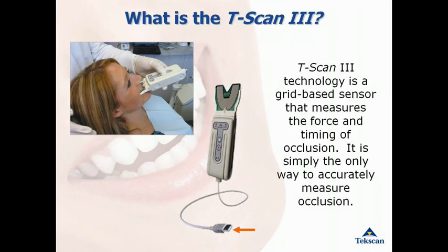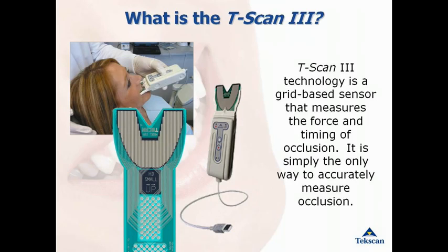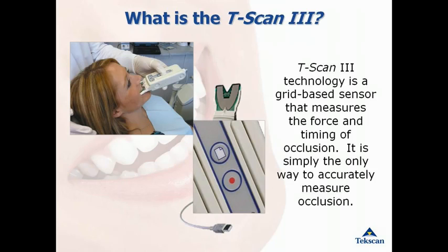The handle connects into the USB port of your PC and is easy to move from one operatory to another. The sensor, designed to fit the shape of the dental arch, inserts into the sensor handle. The T-Scan handle has two buttons that function on the panel: the first button brings up a new recording window, and the second red dot button will start and stop the recording mode. You can record a patient going into maximum intercuspation, being manipulated into centric relation, or performing excursive and protrusive movements.